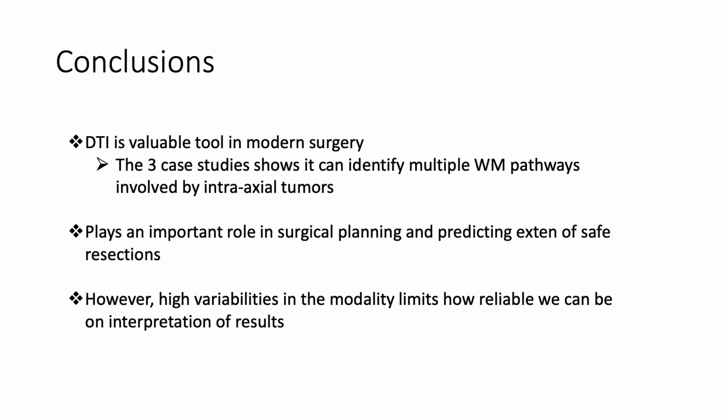Thus, this technique plays an important role in neurosurgical planning and in predicting the extent of safe resection. As in these cases, it can be seen that DTI can be used in conjunction with other imaging modalities for a more holistic pre-surgical planning technique.